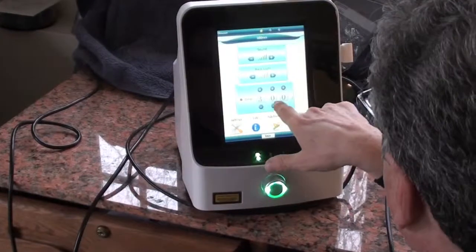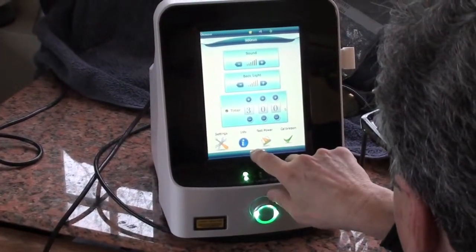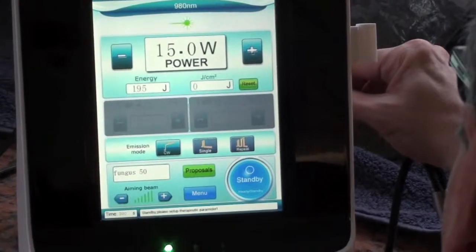You want to put the right time, at least 5 minutes, and we have protocols to show you how to do that. So it's real simple. Always make sure this is tight. If for some reason it's saying the fiber's not connected, you tighten this up a little bit.